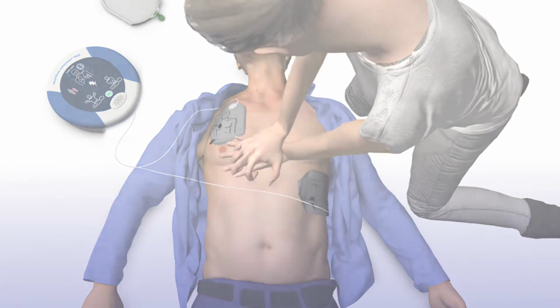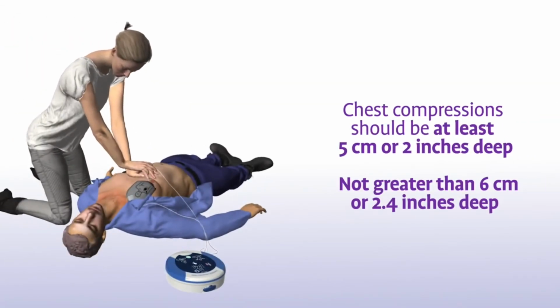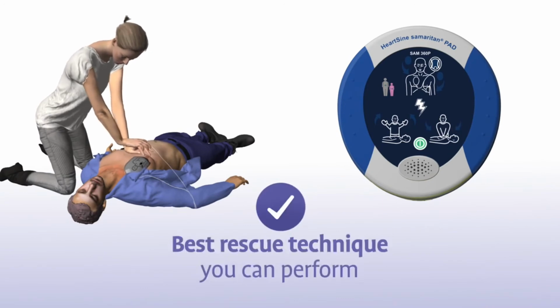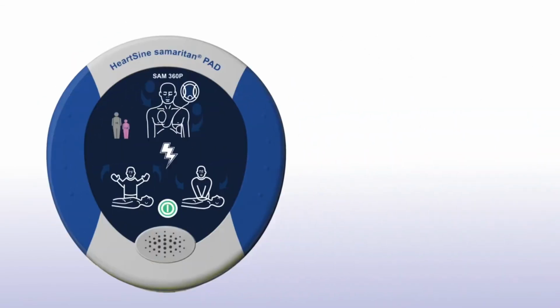Remain calm. In addition to staying in time with the metronome, your chest compressions should have a depth of at least 5 centimetres or 2 inches. This chest depth equates approximately to the size of the patient's thumb, which is about 1/3 of their chest depth. The combination of chest compressions and defibrillation is the best treatment you can provide until medical professionals arrive on the scene.